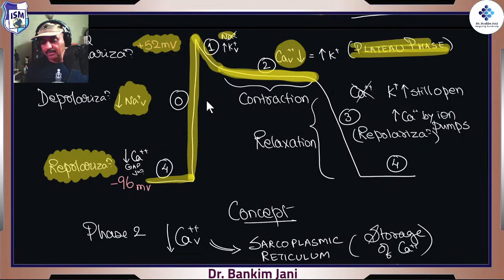This piece of the stage is very important because that gives us what's called the contraction, and we are very interested in this part today because we'll be dealing with the complete electrical system. We'll be dealing with the ECG machine itself, and the electrical system, what is going on in the heart, normal and abnormal both.